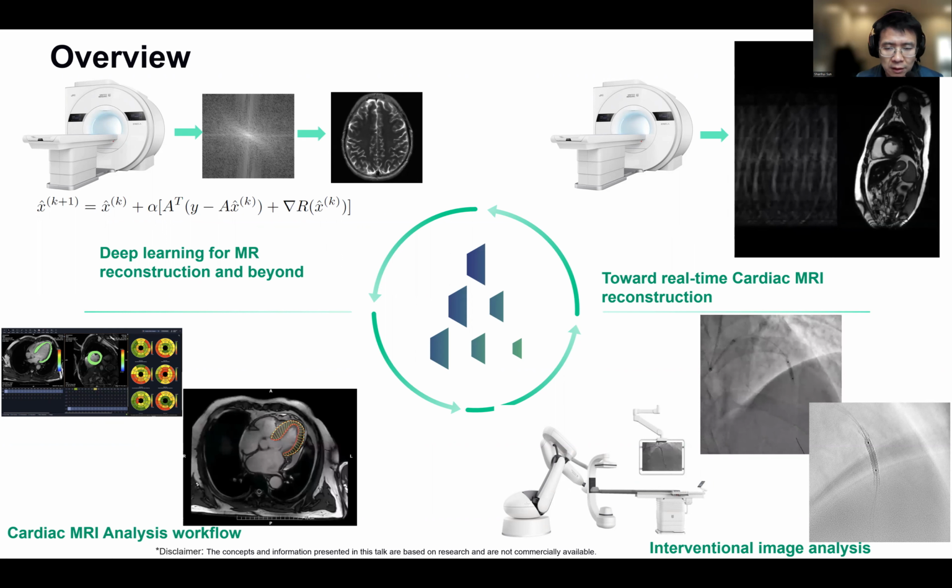Let's recall the MRI reconstruction from undersampled k-space data. Actually, it is an ill-posed inverse problem. In order to recover the data, we could utilize optimization, right? For the ill-posed problem, we have to put an image regularizer R in to reconstruct the image. If the regularizer R here is differentiable, we could utilize a gradient descent optimizer.